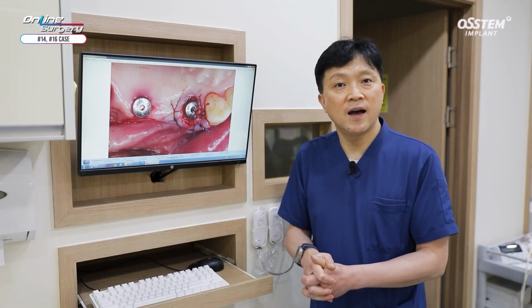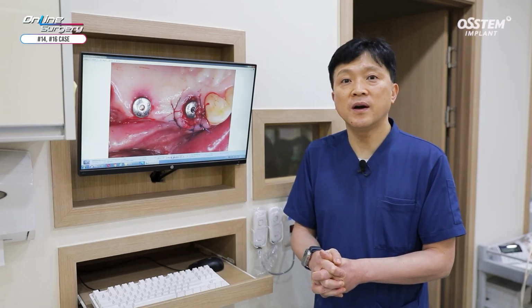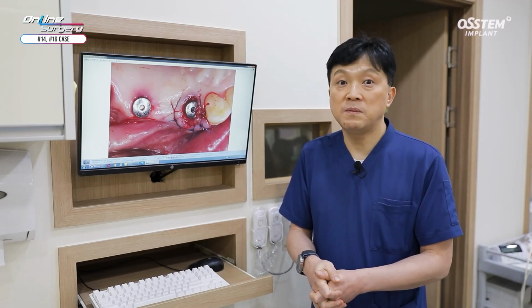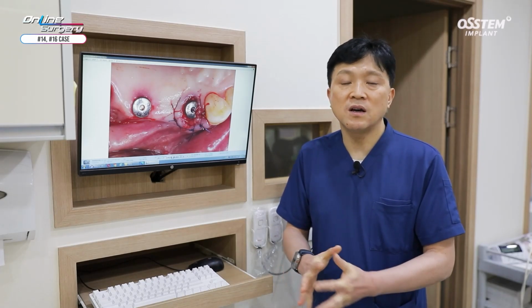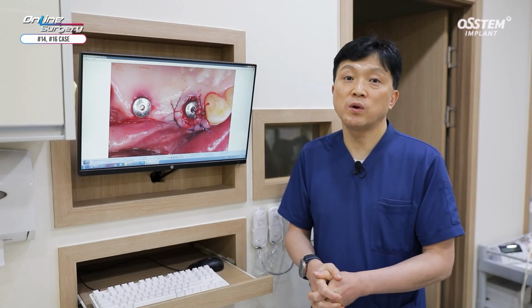That's what many people think, but the most important part is that implant position needs to be ideal. Only then will we be able to utilize bone graft materials and membrane to the fullest. My opinion is that if implant position is not good, you'll not be able to get good results.